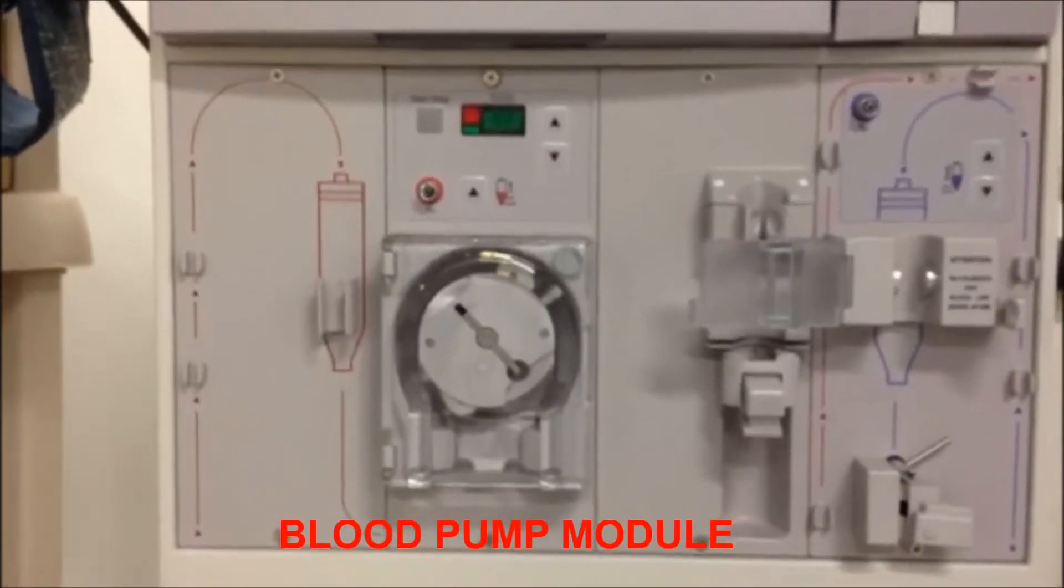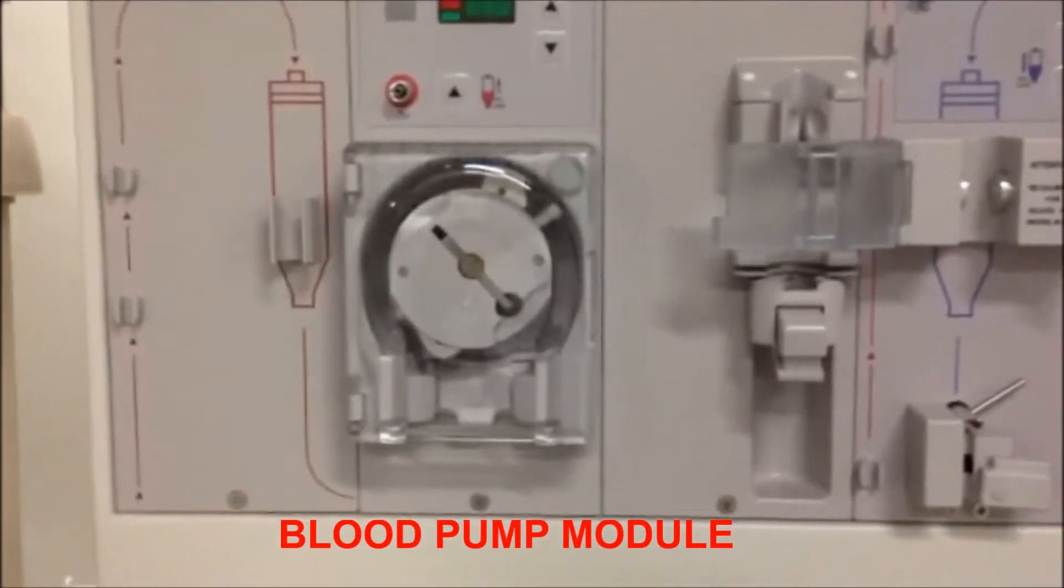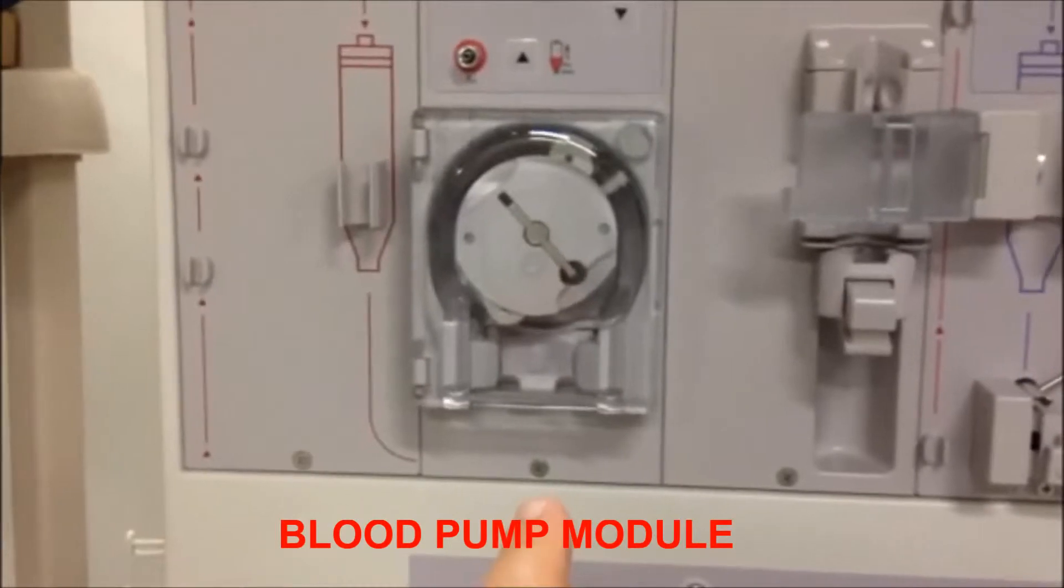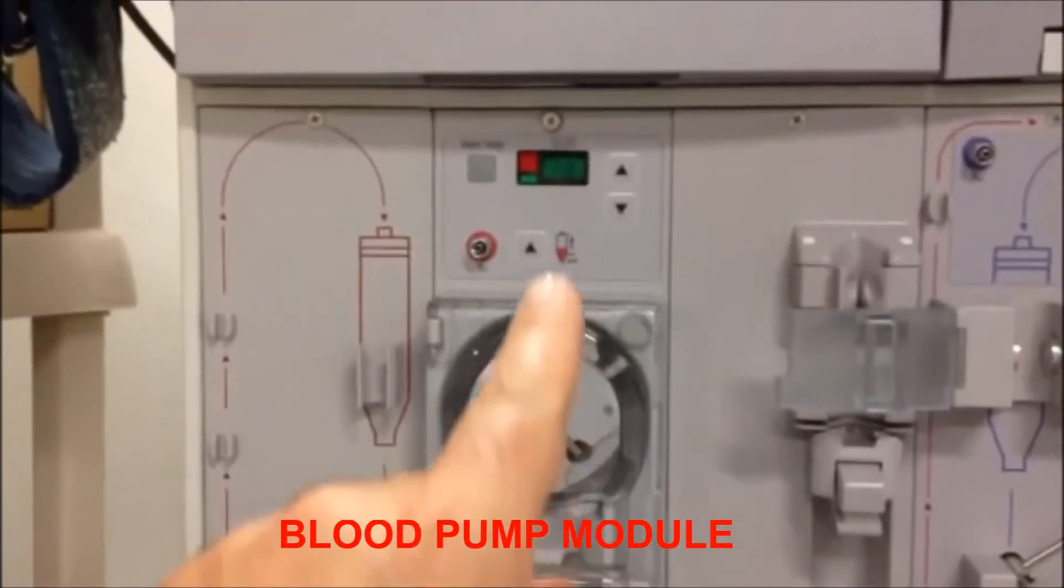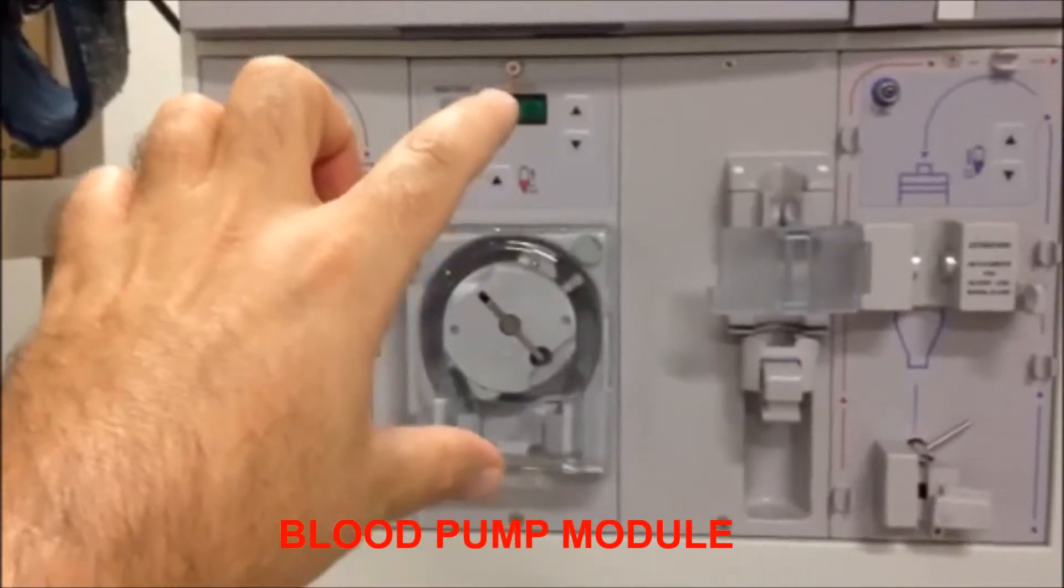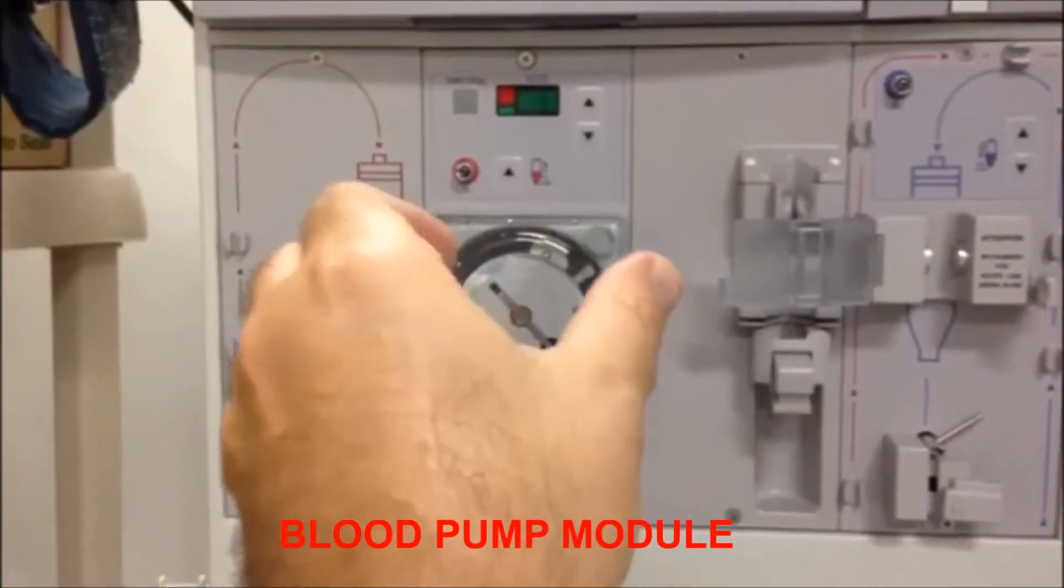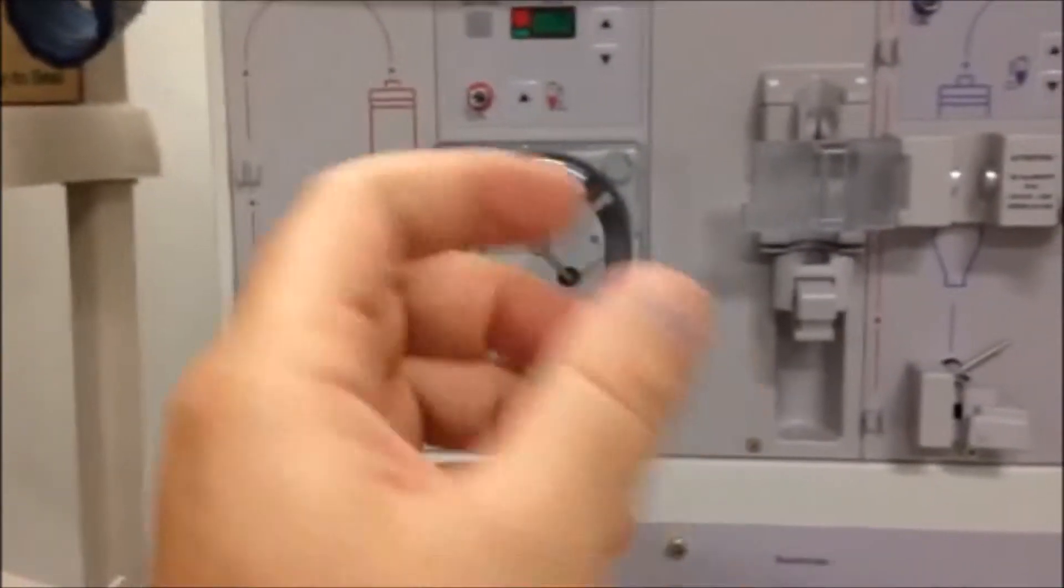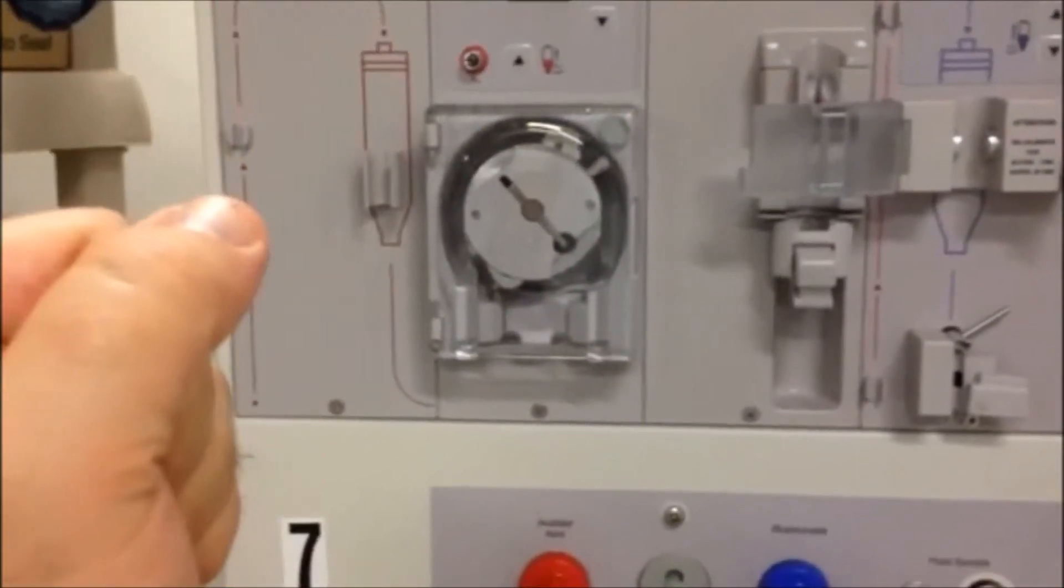This is the blood pump that is going to need to be removed. There is a screw right here, and there's another screw right here. When these screws are removed, this module will come out like a book but will be attached to elements from the back, and I will show you how it is attached.